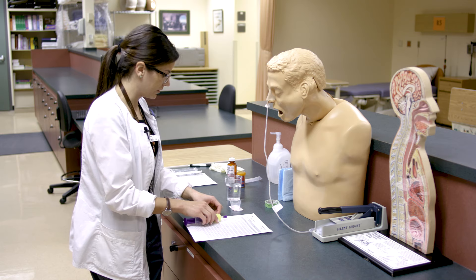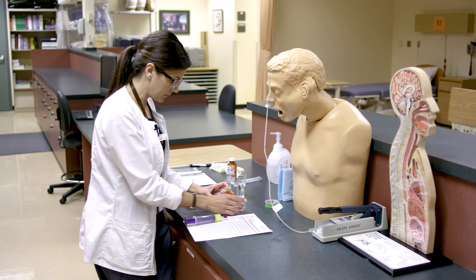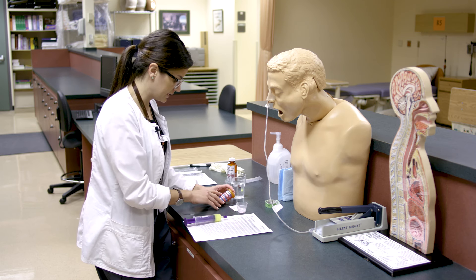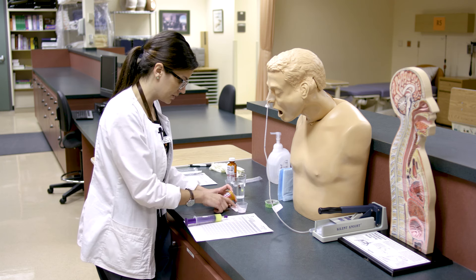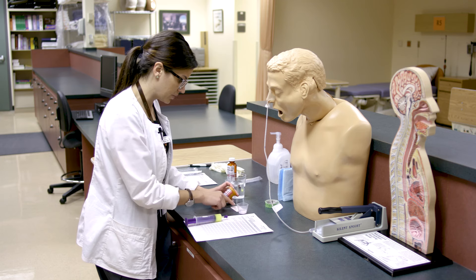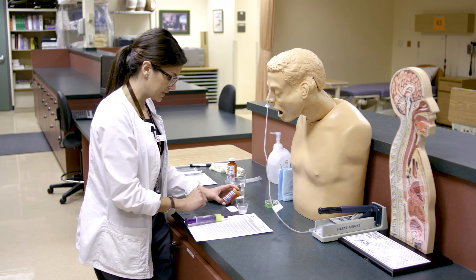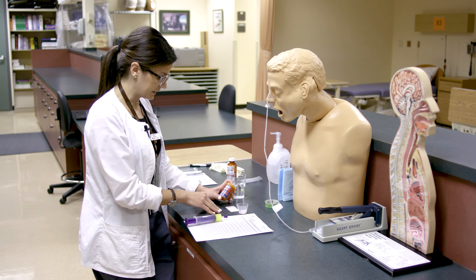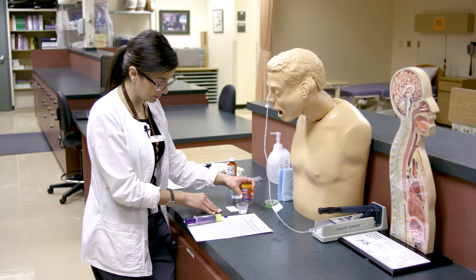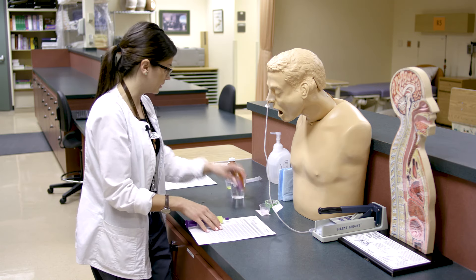For the second check, keep the containers readily available. First, diphenhydramine — same as Benadryl — dose is 25 milligrams. These are 25 milligram tablets, and we crushed one tab, which is what we have written for volume. The route is per nasogastric, which is why we crushed it and diluted it with water. He's getting it every six hours. Second check for Benadryl is complete, and we can put the container away.